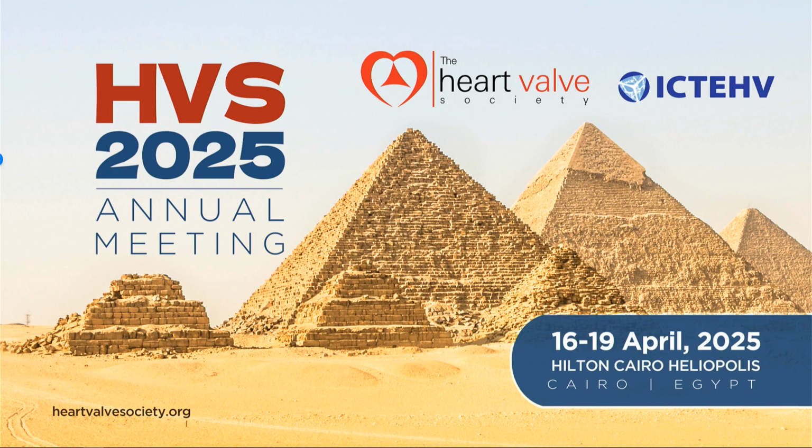There are no bicuspid valves with less calcium that we find that easily. And so the trials will have some way to stratify, because Raj's paper suggested that if you have too much calcium in the raphe, then there is a little bit more chance of having stroke or PVL. So those patients may be excluded. But this is the challenge of the clinical trial.